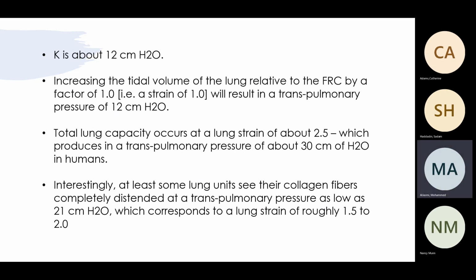There's a machine with a magnetic, like it's a CT scan, like not CT scan. You put leads in the lung, and it gives you a magnetic field. It calculates how much of the lung is affected by the consolidation and how much of the lung is not affected by the consolidation. And it will give you the FRC, and then you can titrate your PEEP and volume according to it. But there are no big studies to say yes, we should all start doing this.